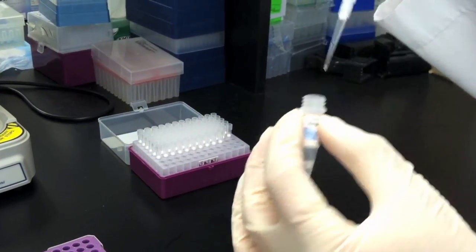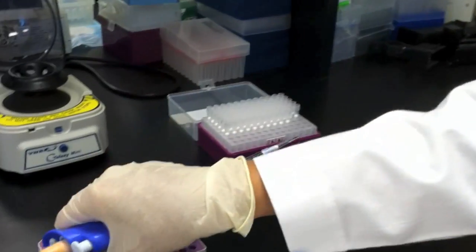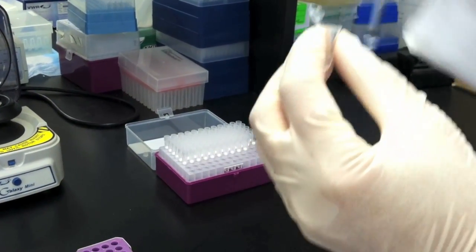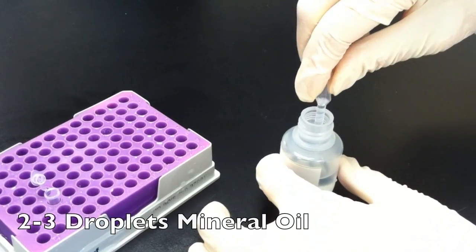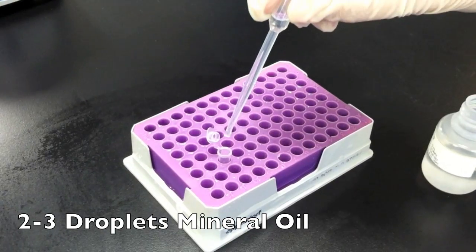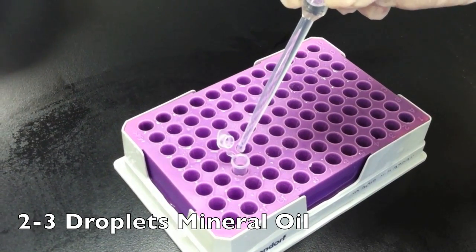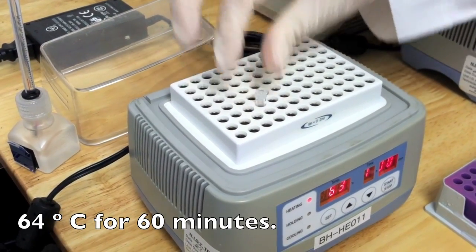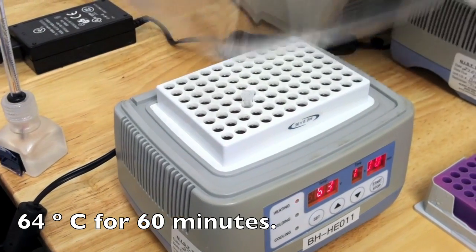Add 25 microliters of the master mix to the 25 microliters diluted sample in the 0.2 milliliter reaction tube. Drop 2 to 3 droplets of mineral oil to the reaction tube using a disposable transfer pipette. Place the reaction tube in a 64 degrees Celsius heat block for 60 minutes.